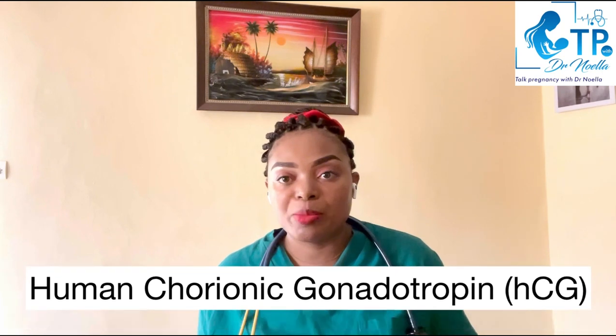So how do you take a pregnancy test correctly so that at the end, once the result comes out, you are sure you did the right thing? The pregnancy test, what does it measure? It measures the hormone called the human chorionic gonadotropin hormone. This is the hormone which is produced once you are pregnant. So it measures the level of this hormone produced in the body. You can either use urine or blood in order to test this hormone in the body. Once you test this hormone, if it's positive, it means you are pregnant. If it's negative, it means you're not pregnant.